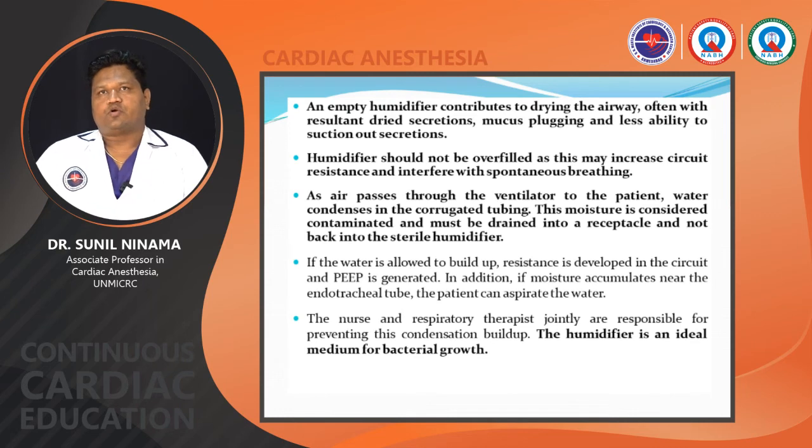An empty humidifier contributes to dry air, which dries up all the secretions in the bronchi as well as in the lungs, causing mucus plugging and less ability to remove secretions. The humidifier should not be overfilled, as it may increase the circuit resistance and interfere with spontaneous breathing. As the air passes through the ventilator to the patient, the water condenses in the corrugated tubing, and the moisture is considered contaminated and must be drained into receptacles and not back into the sterile humidifier.